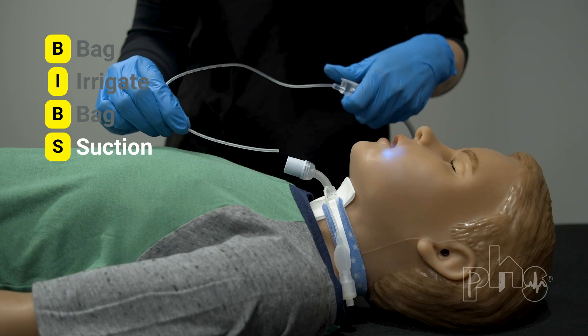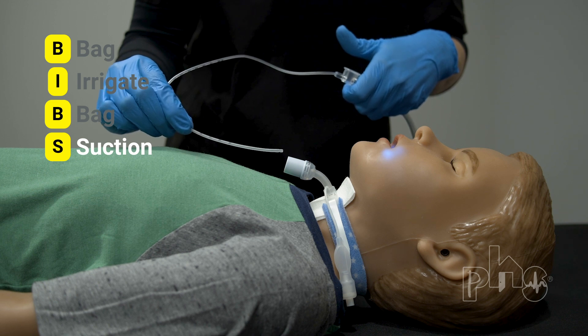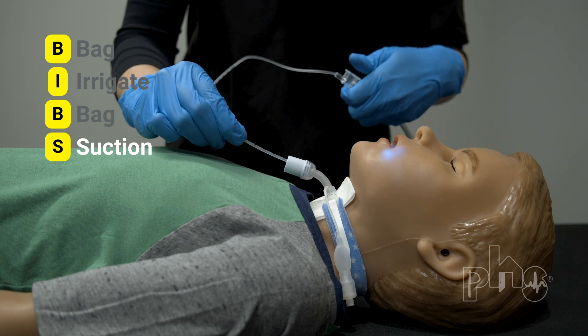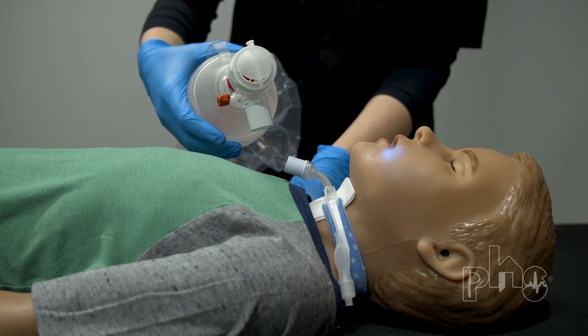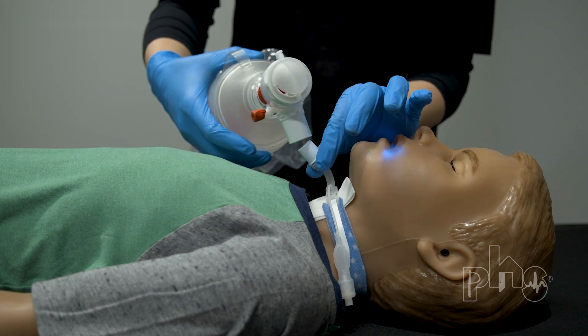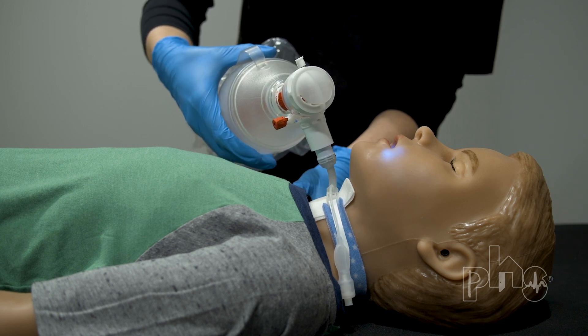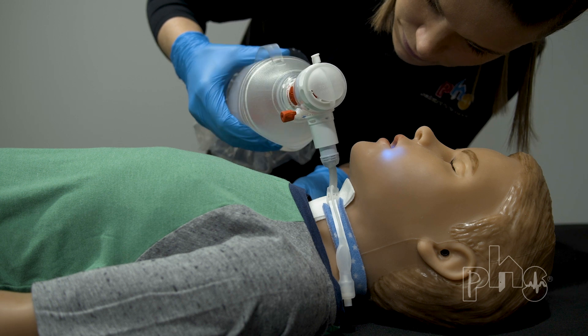S is for suction, which means suction the trach tube. Suction to the predetermined safe suction depth. After suctioning, connect the resuscitation bag to the trach tube again. Squeeze the bag firmly and repeatedly. Look at the patient's chest to see if it rises each time you squeeze the bag.